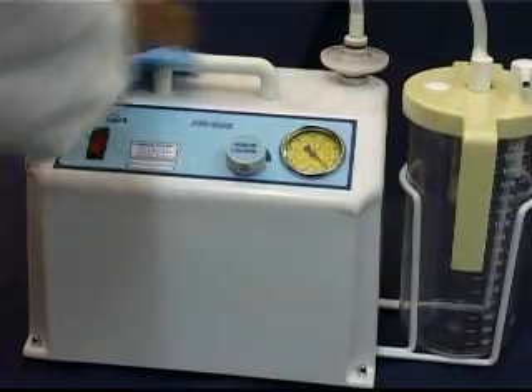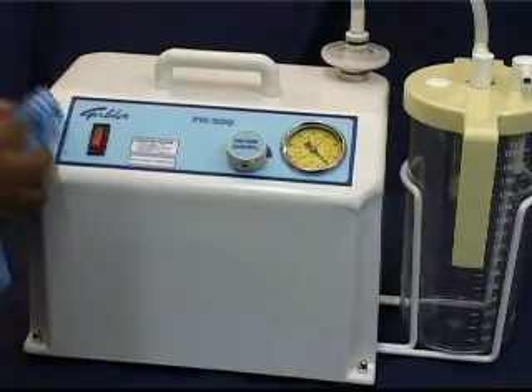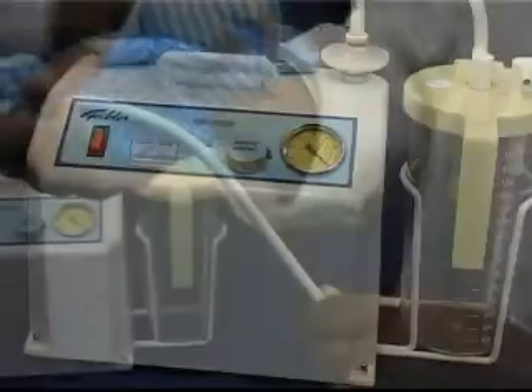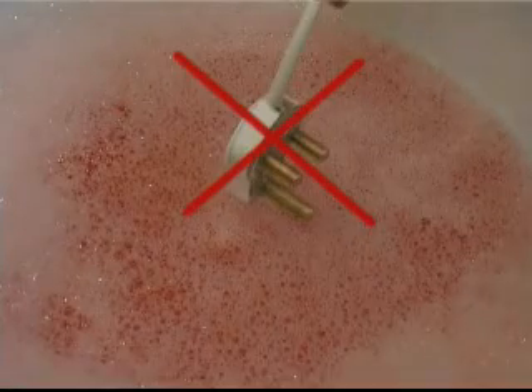Clean the outside of the unit by simply wiping it with a damp cloth or a mild disinfectant solution. Take care not to soak the unit. Wipe the electrical cord and plug. Do not immerse them in water.